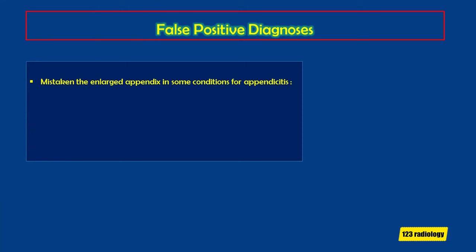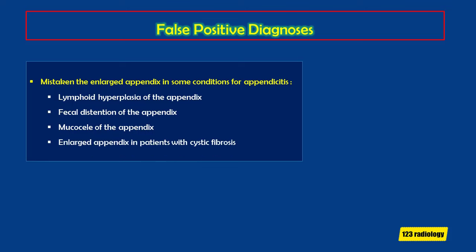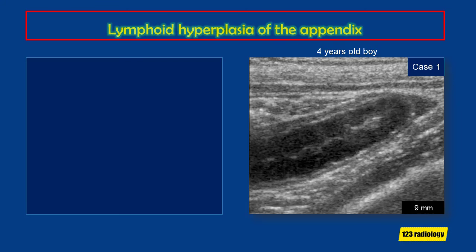Causes of false positive diagnoses include conditions that cause an enlarged appendix mistaken for appendicitis: lymphoid hyperplasia, fecal distension, mucocele, and enlarged appendix in patients with cystic fibrosis. In this example, a 4-year-old boy had an ultrasound unrelated to lower abdominal issues. The appendix measures about 9 mm, but the wall is very thickened with a cobblestone pattern and nothing in the lumen — this represents lymphoid hyperplasia of the appendix.